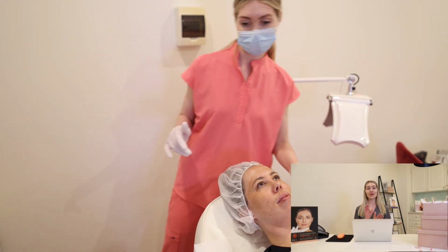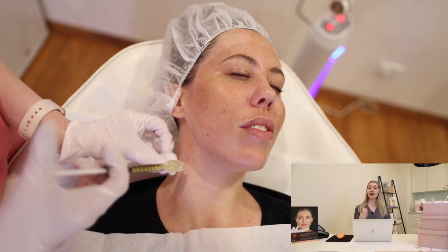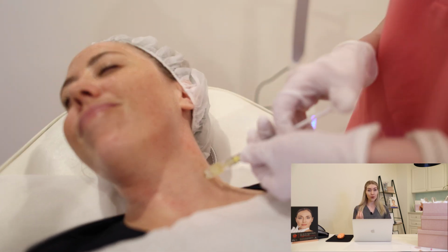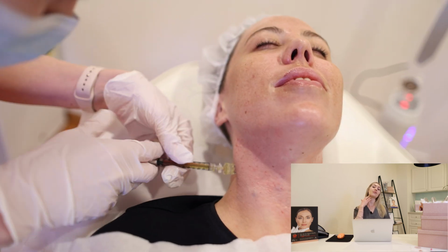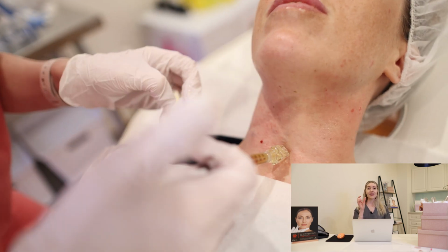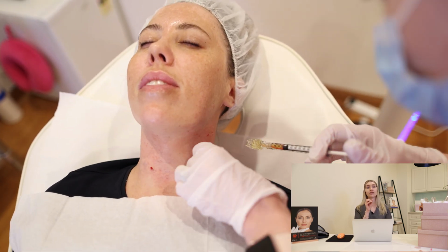So what we did after we took her blood and we spun it in the machine in the centrifuge, I then used, and you can see here, the 5-prong stamp. Now this is my favorite way to do the neck. I find clients find it more comfortable in the neck region than the needle, and it also means I can do the treatment a little bit quicker for you as well. Now remembering I always apply the topical numbing, which she had working while we did the TCA Peel to her face. And then I put a full mil of the plasma onto each side of the neck, as you can see, working down the whole sections. And then with the remaining mil, because I got 3 mils of the platelet-rich plasma, I then targeted those little fine lines, and I really got into those lines to make sure that I give her the best possible treatment.